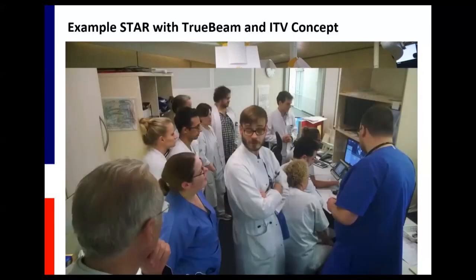And here you see, not Corona, before Corona, of course, the team that's needed for treatment, and we have many physicists here. We have many clinicians here, therapists, and the boss on the left-hand side, and the cardiologist. We have 2 cardiologists on standby should anything happen to the patient during treatment. So that's really important, to have a cardiologist on standby during treatment and doing the ECG monitoring in the room.